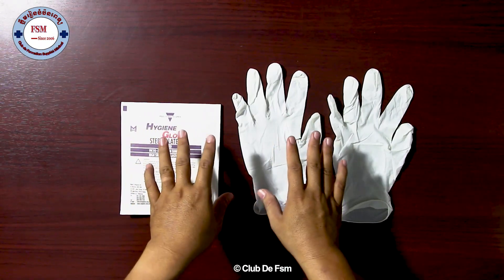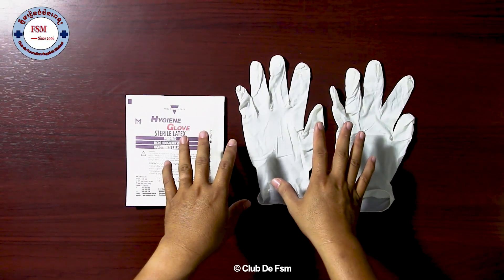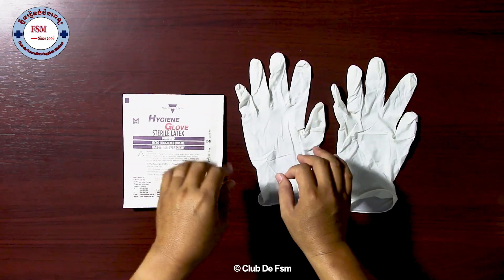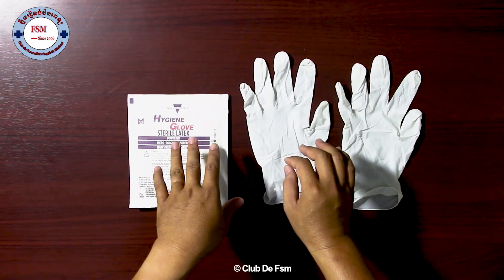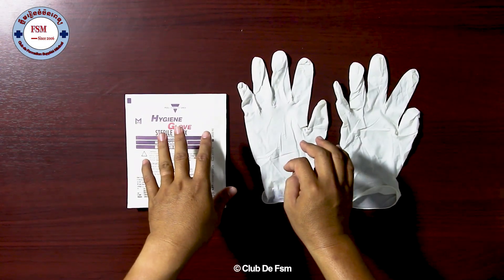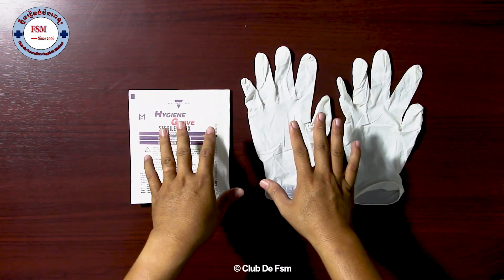We have two kinds of gloves: non-sterile and sterile. For non-sterile we have three sizes — small, medium, and large. For sterile gloves we have mini size, and then 6.5, 7, 7.5, or 8. It depends on the hand of the surgeon.